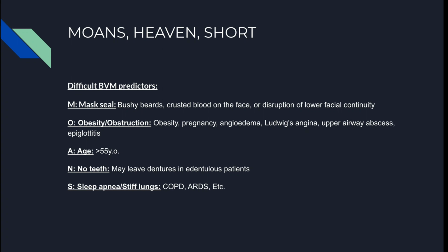if we're going to be doing bag mask ventilations, we should try to keep those teeth in, because that's going to provide us with better facial structure, so it'll make it a little easier to bag the patient. We've all seen those patients that take their dentures out and get that sunken mouth type of appearance, and that could be very difficult to get a good mask seal and bag the patient.